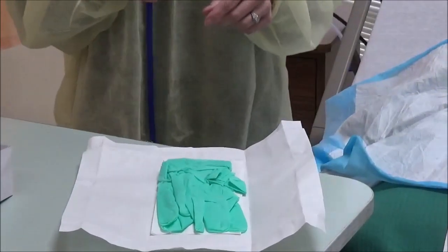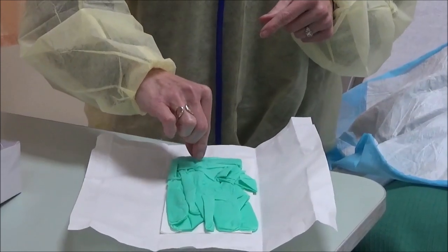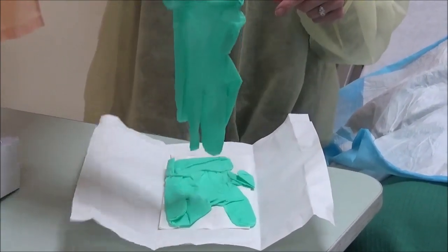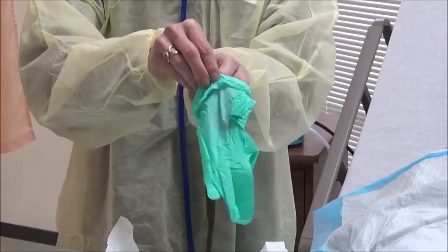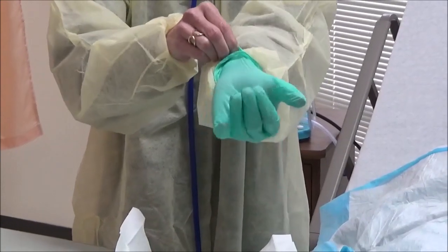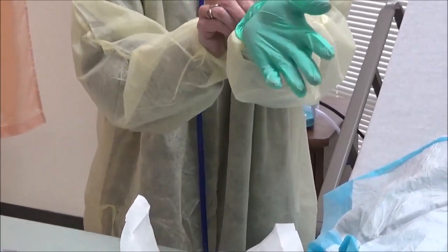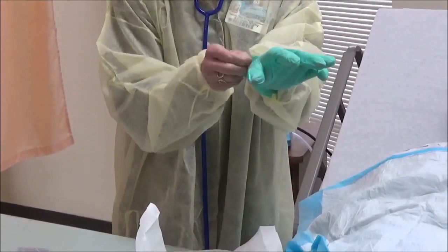Okay, my first sterile glove. When you put on sterile gloves, if you remember, you touch the inside of that first glove, and I'm going to put it on, making sure that I only touch the inside, and I make sure I get that glove on completely. I'm going to make sure it kind of comes over my gown a little bit.